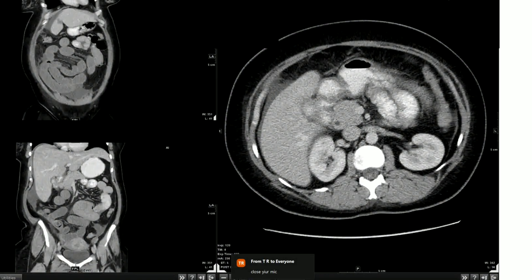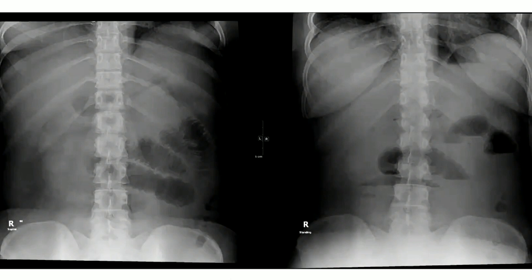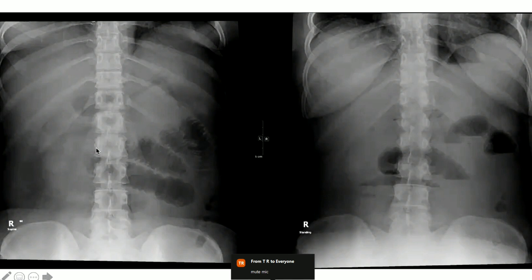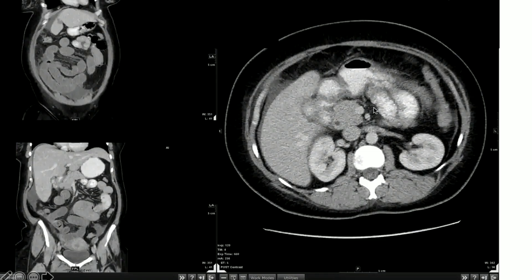Going back to the x-ray, we can see this is a supine x-ray and this is the standing x-ray. There are multiple dilated small bowel loops with air-fluid levels. From the abdominal x-ray you can straightforwardly say there is a small bowel obstruction. There is no pneumatosis intestinalis and no free air under the diaphragm. The next step is CT.